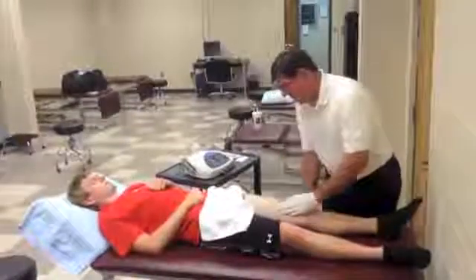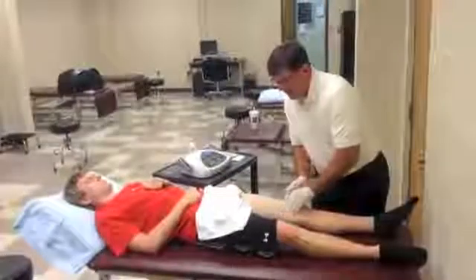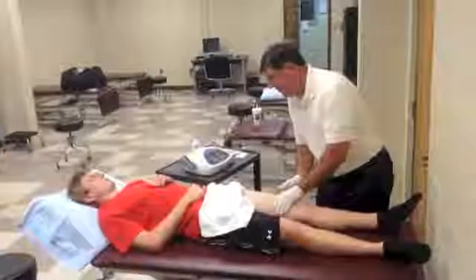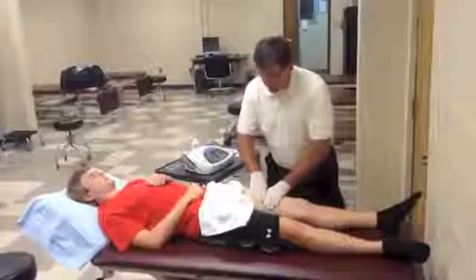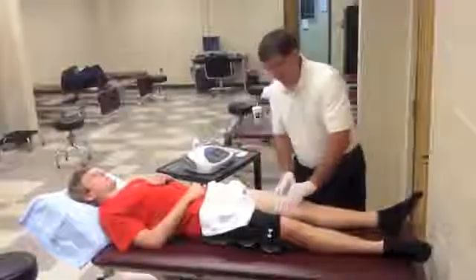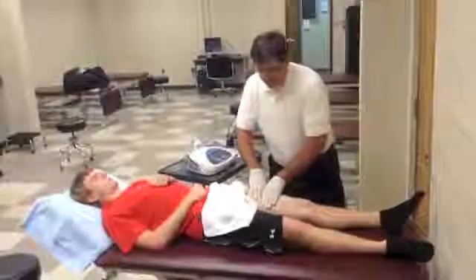The big point is that this allows the clinician to become involved in the situation — it allows you to feel for areas of tenderness, adhesion, and edema formation. This technique is very good at helping to remove those, both from the effect of the electrical fields as well as from the actual pressure that you apply in the direction of return circulation.